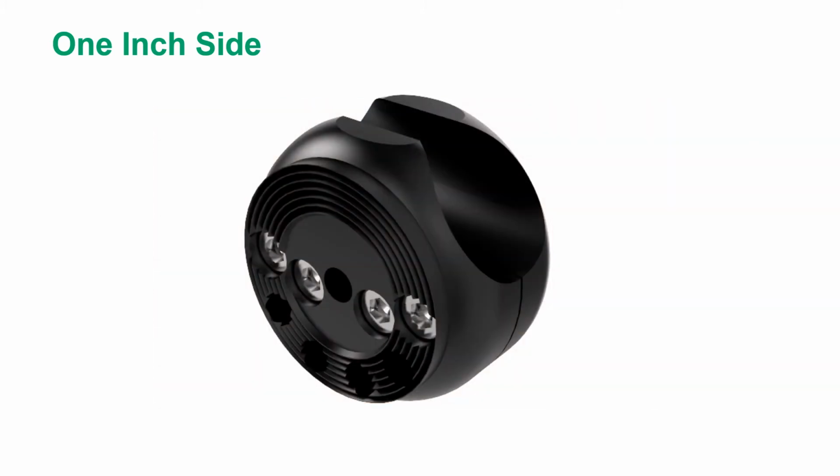One key feature of the side clamp is how much less space the clamp needs at the top of the frame. If there isn't adequate clearance at the top of the wheelchair frame, for example, something blocking the top of the wheelchair tube, such as the wheelchair seat, a side clamp could be the best fit. Remember, the 1-inch round would not work here because it completely encircles the tube and requires more space. The clamp comes apart by removing these screws. It is then fitted onto the tube and reassembled. You might use this type of frame clamp on a round wheelchair frame tube if you do not have adequate clearance for a 1-inch round frame clamp.